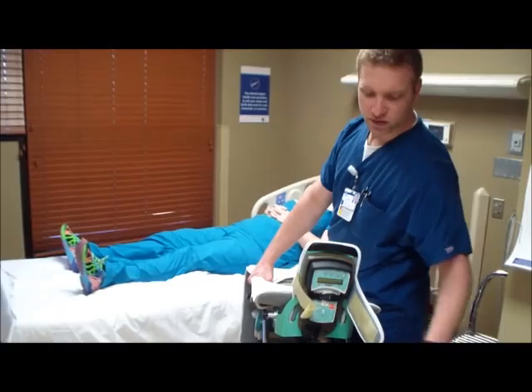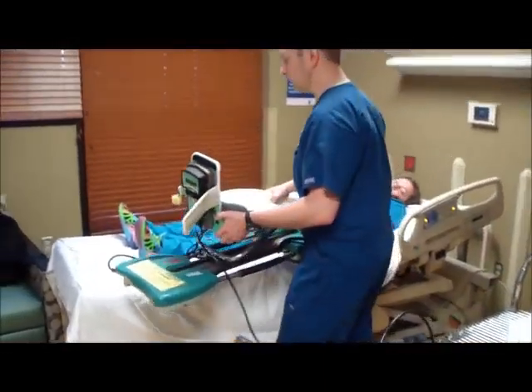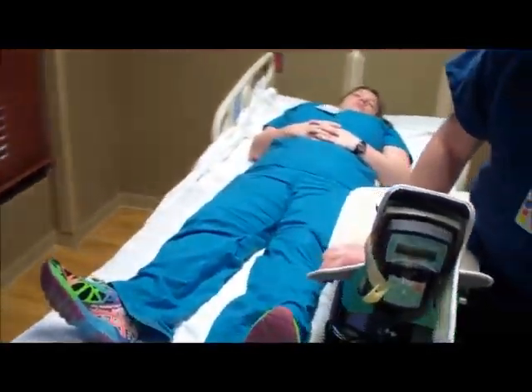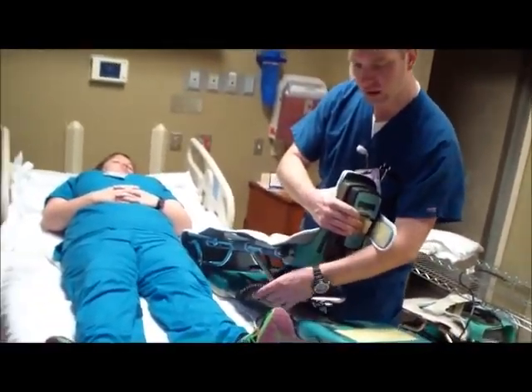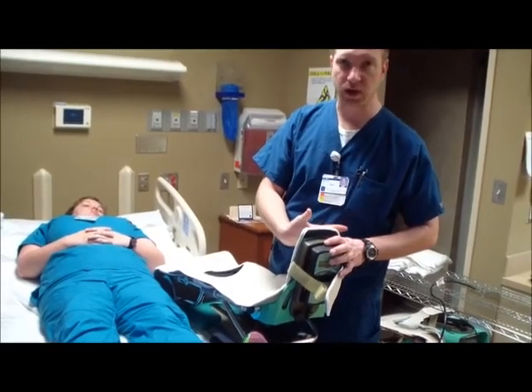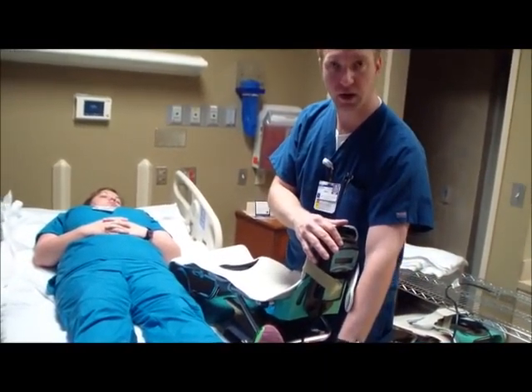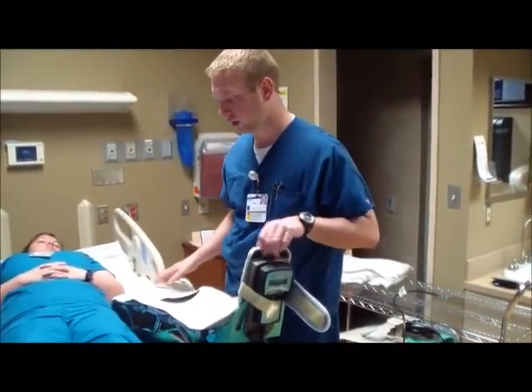So it helps to not have the CPM plugged in when you're placing it. You want to bring it all the way over. And if you're placing it on the left leg, you want to place the cord running underneath the CPM. If you're placing it on the right leg, just based on where the plug is here, there's no issue with the plug location.